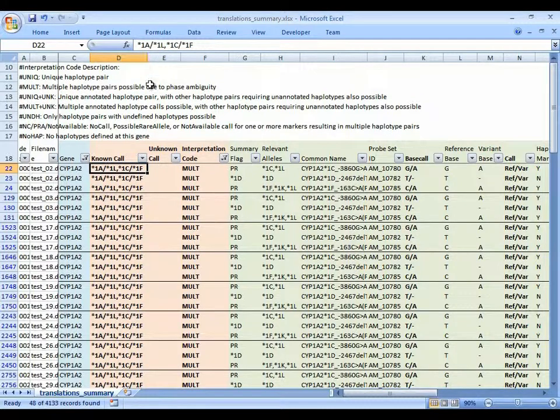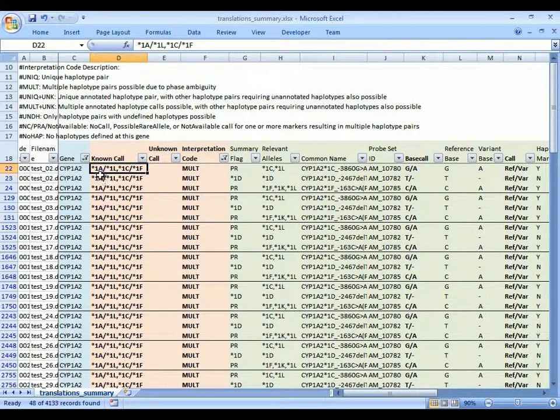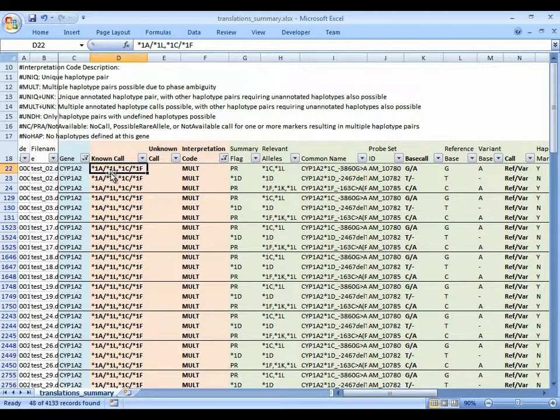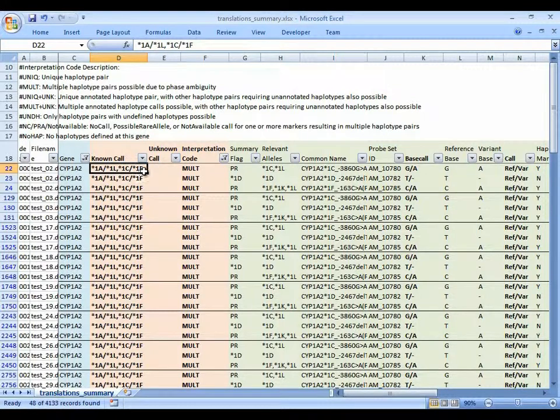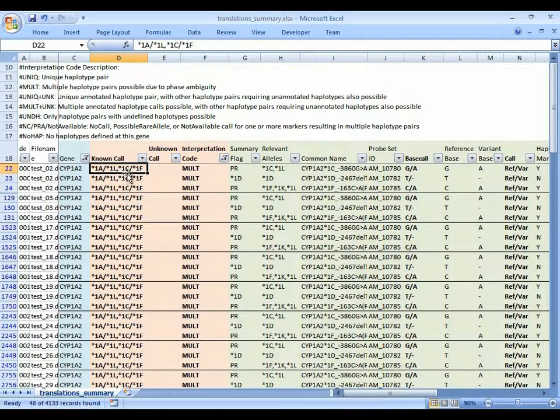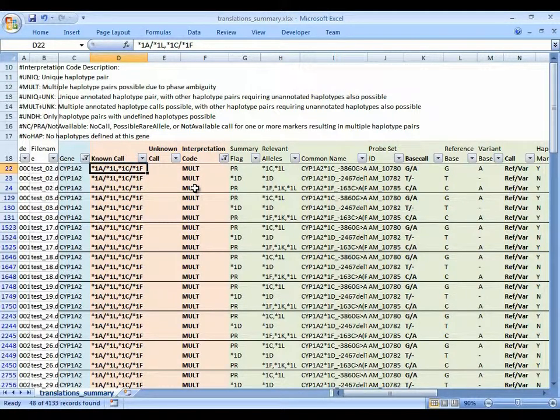And both interpretations are reported. In this case, star 1A haplotype is no variants and star 1L means both markers are variant on the same chromosome. Star 1C and star 1F are the names of the alleles when one variant is on one chromosome and the other variant is on the other chromosome. So, both are possible. The multiple code is given.